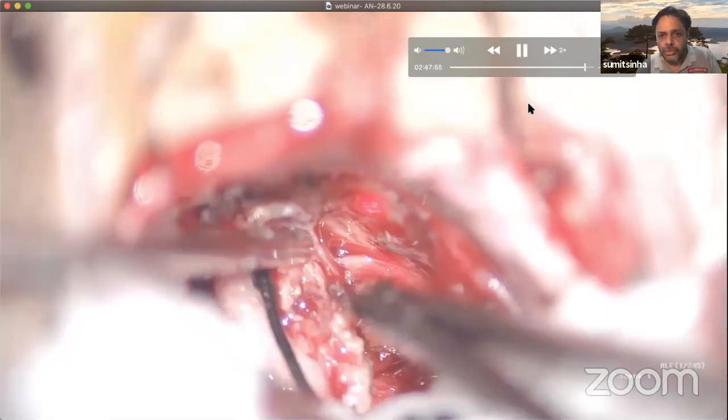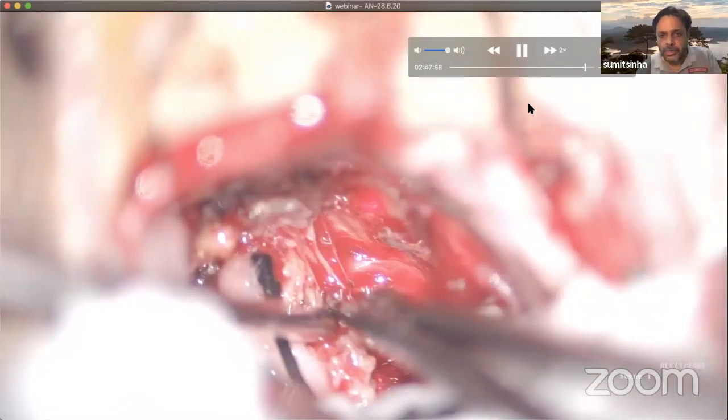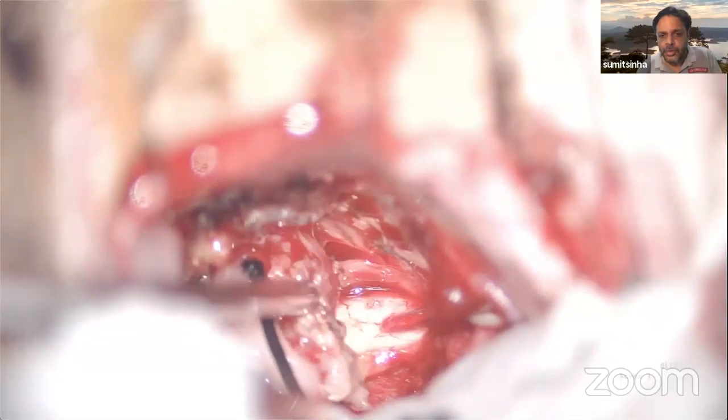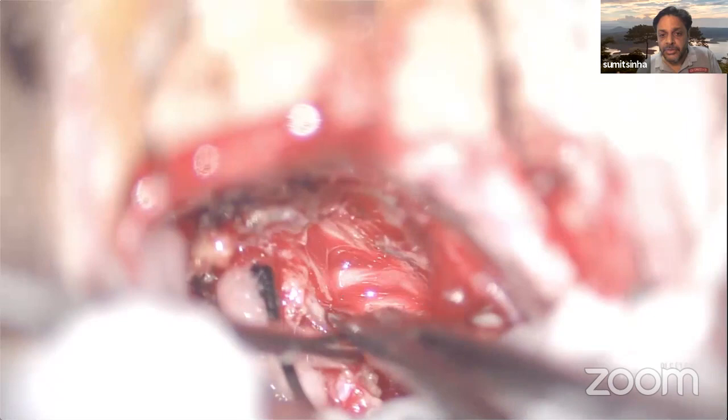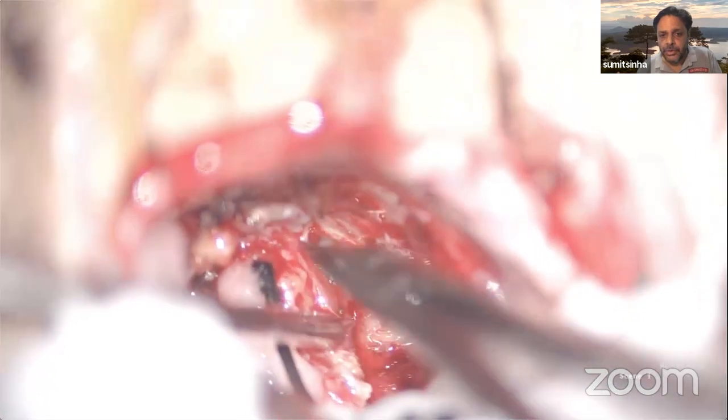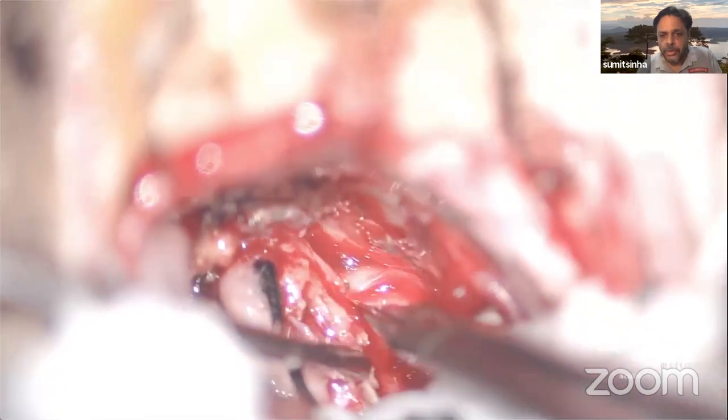I want to show it in the normal speed here because this is important. Cut more of the tumor capsule. Remember, there is no arachnoid over here. This is the tumor capsule.